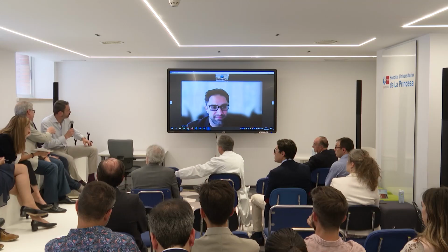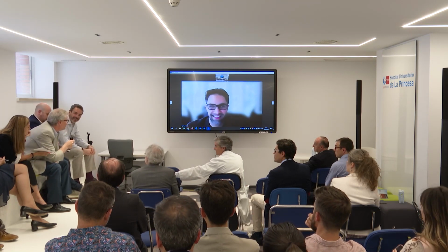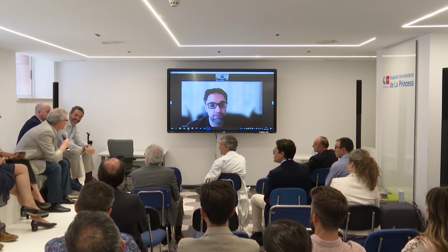Okay, we have Adnan who has a comment. Ziad, a great talk for sure. Thank you. Great theory. But here we have the practice. We have the experience in my center, at least, with hundreds of cases of IVL. Just to tell a story, the rep of the company came and did proctoring for the first 10 cases. At least 4 of these 10 cases needed an OPN balloon at the end. I didn't tell it before. And I said to him, please put it in a set: 1 IVL plus 1 OPN. In order.